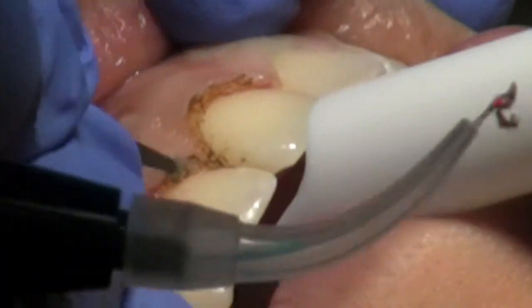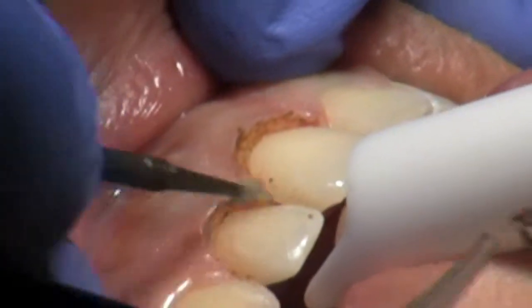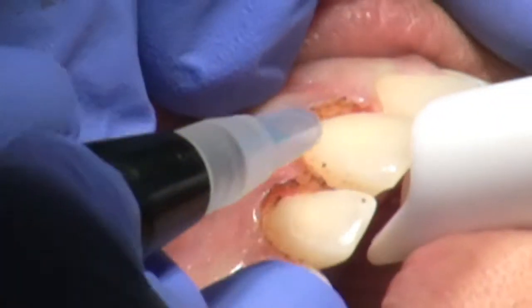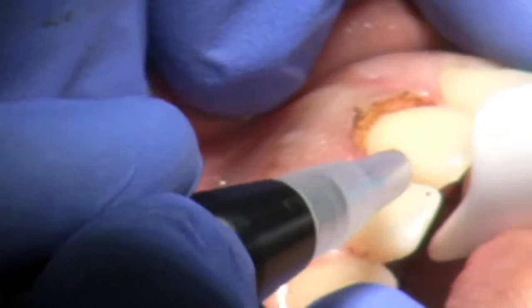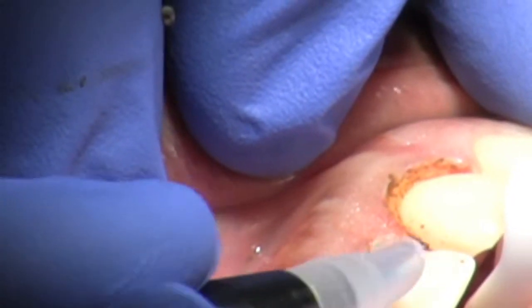You'll start to feel really vibrant. So you might have to clean a little bit of the char out. And then look at this little edge you've got there — see that? So now you've got to get that as well. You want everything really nice and smooth.